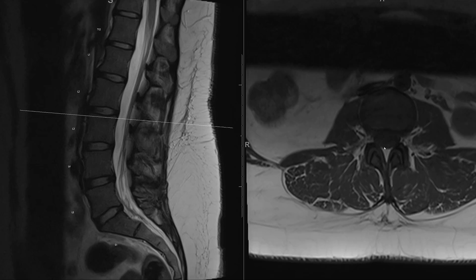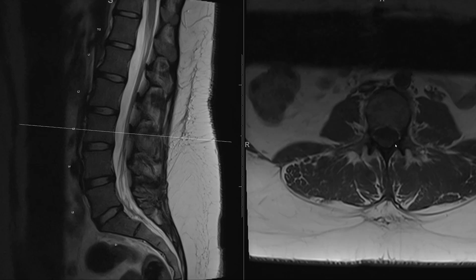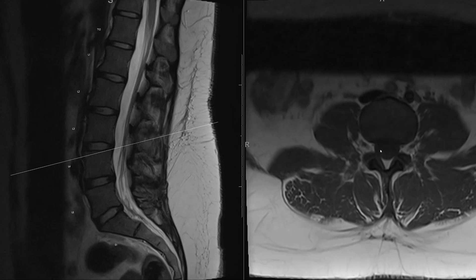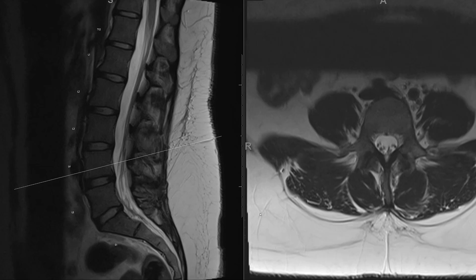Here's a T1-weighted image. CSF is dark on T1, and now we can see the fat very well, separating it from the CSF. As you scroll up and down, the epidural space is extremely small at the level of the pedicles, but as we get down to the area of the neural foramen, the epidural space is larger and contains some fat.